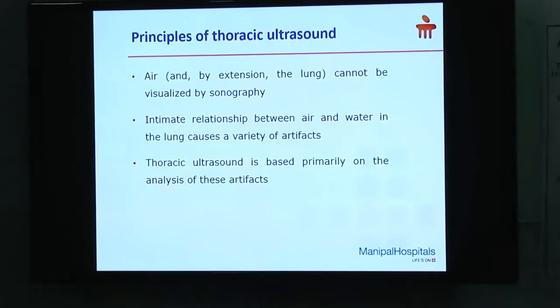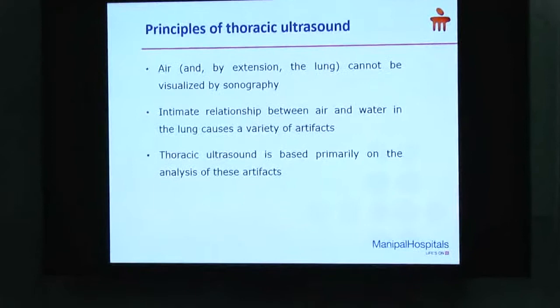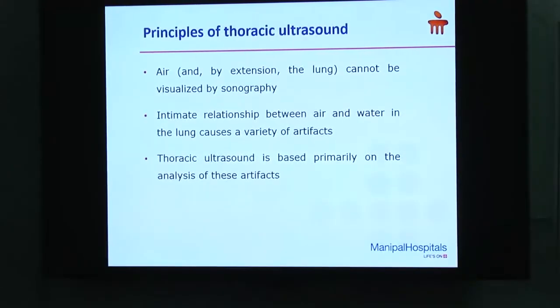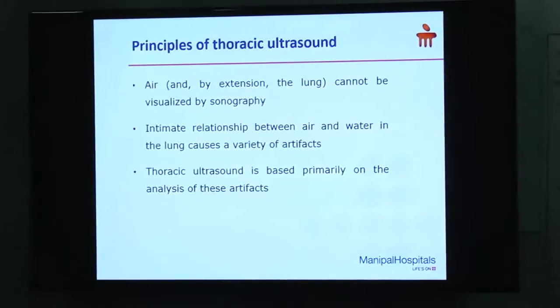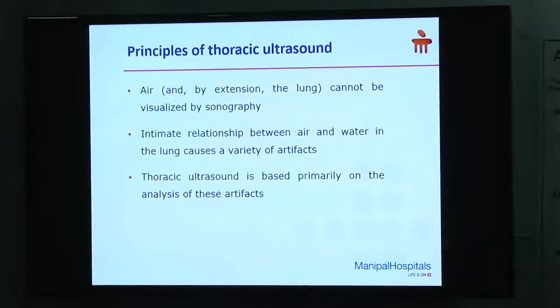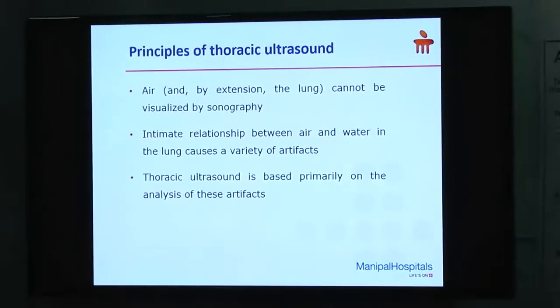Now, it is very interesting about lung ultrasound, because as we know, ultrasound is very poor when there is air, because air is a very poor conductor of ultrasound. That's why even the radiologists never thought that ultrasound can be used for assessment of lung.